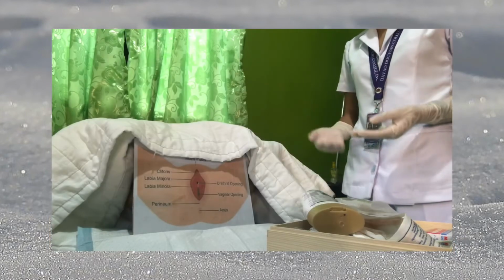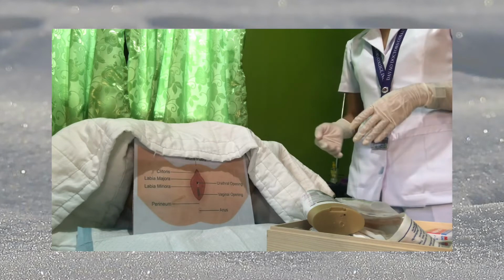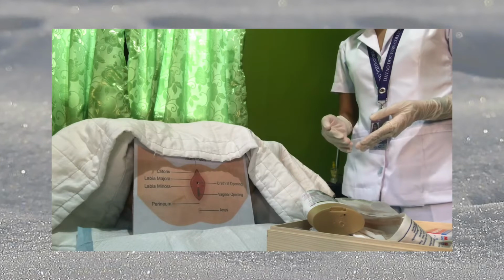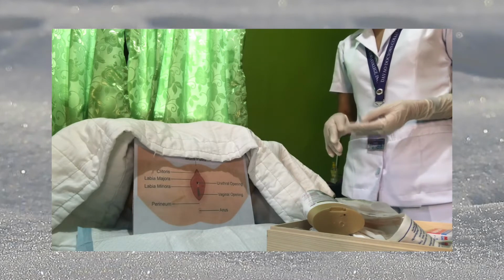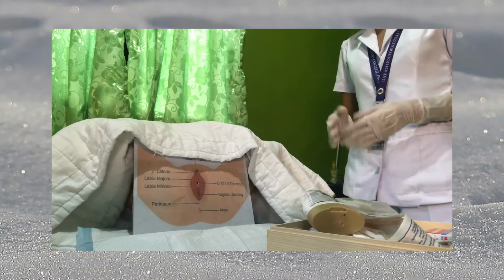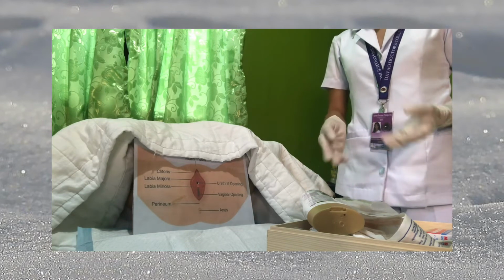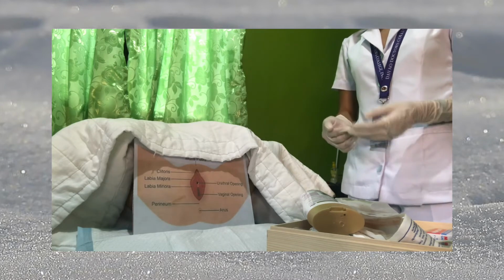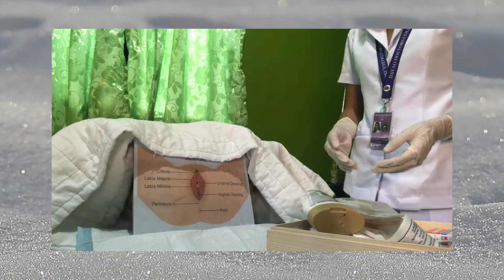Now, use the sterile forceps. Cleanse the area using the cotton ball with betadine. This is done because thorough cleansing of the meatus and the area surrounding it reduces the possible introduction of microorganisms into the bladder. Then open the set and put on the sterile gloves to prevent the spread of microorganisms to ourselves and to our clients. And of course, put on the draw sheet.